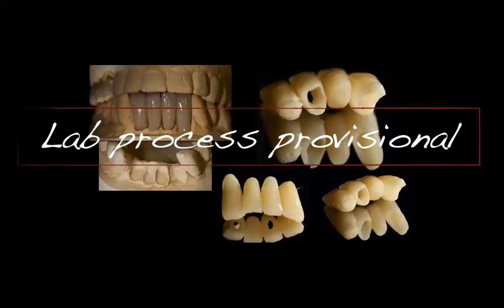Let's talk about the lab provisional, okay? One of the most important parts of immediate load is a provisional. Now, one thing I'm going to give you as advice: if you are sending a case out to the lab to make you a temporary, they make you a temporary like you are restoring a natural dentition.